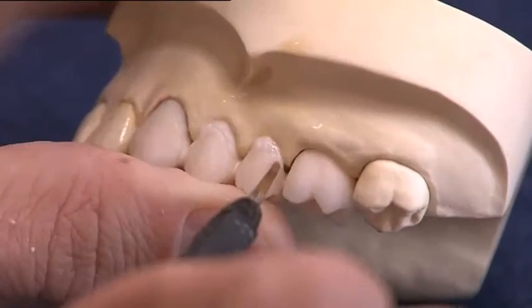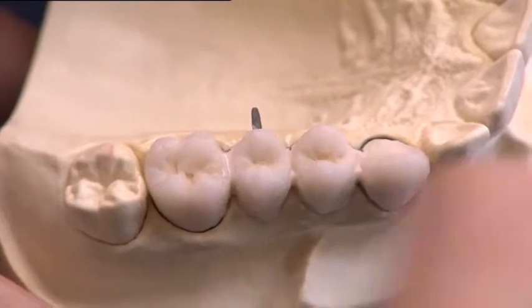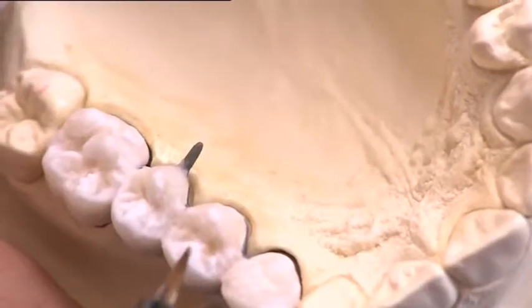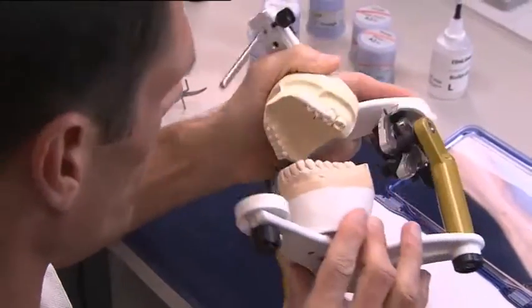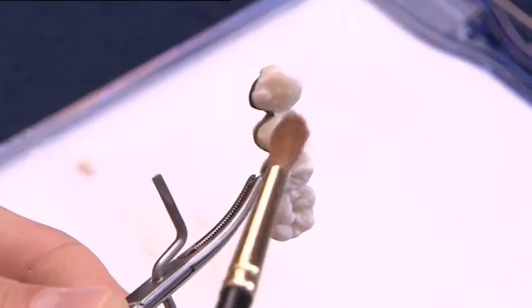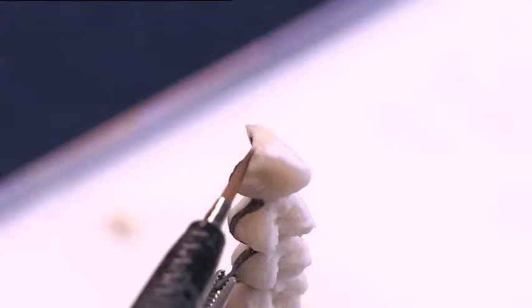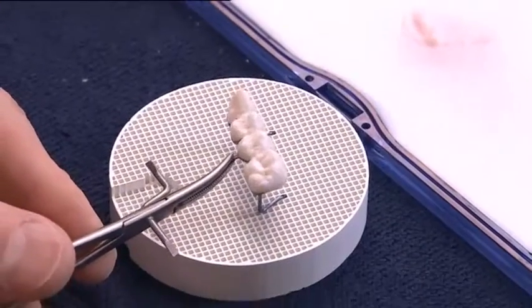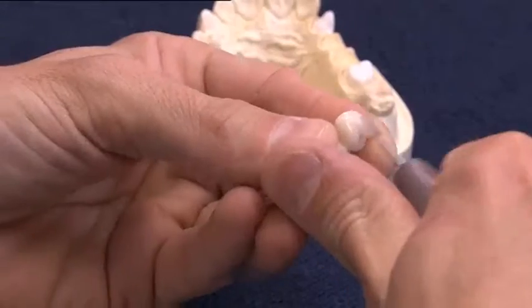Missing areas and proximal contact points are filled with dentin incisal materials. For opalescent effects, the materials from the Impulse kit are available. Fit and function are checked in the Stratos. The ceramic surface can be pre-densified by running a large dry brush over it. Provide adequate support for the restoration on the IPS Uni-Tray and fire the bridge in the Programat furnace.